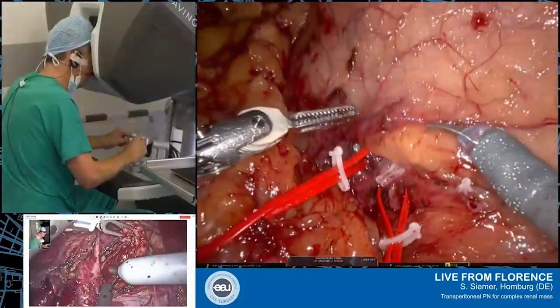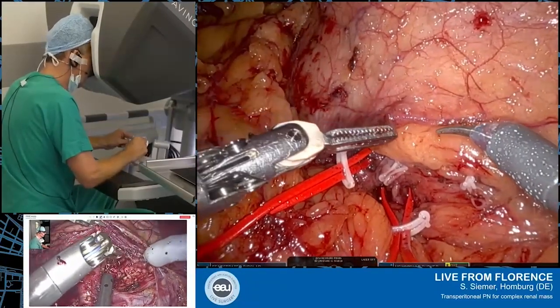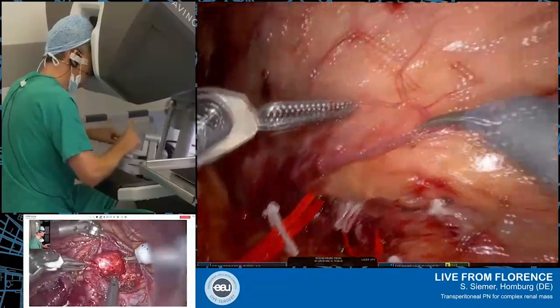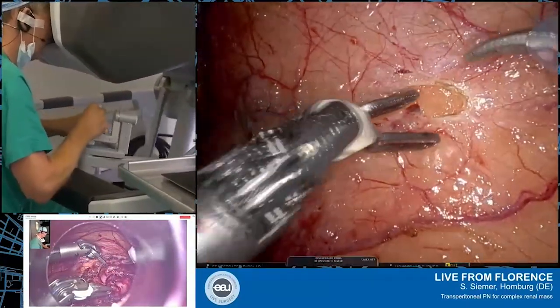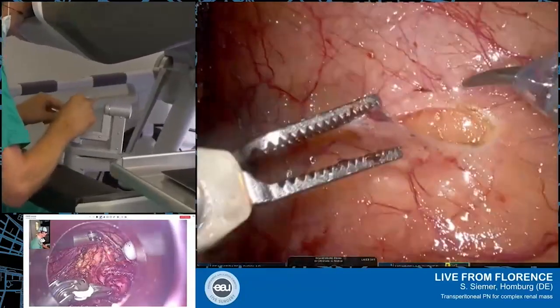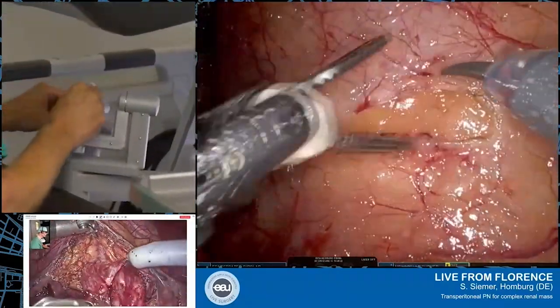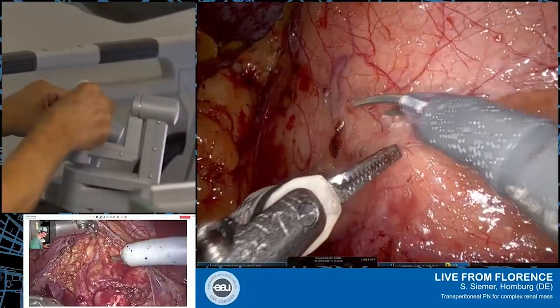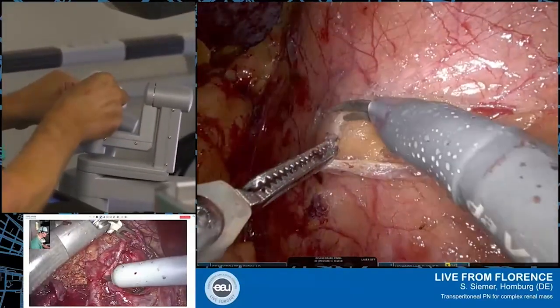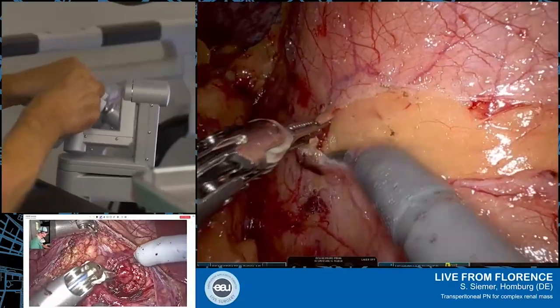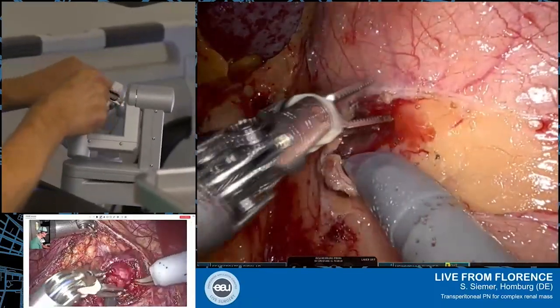Regarding the choice between no clamping, selective clamping, and complete clamping of the pedicle: normally I clamp the artery because it gives a very good view to the tumor, especially in such a complicated situation — though it depends. After we immobilize the kidney and tumor, I think I will clamp both arteries, since the 3D reconstruction showed that both arteries have a branch to the tumor. So I will not do selective clamping.